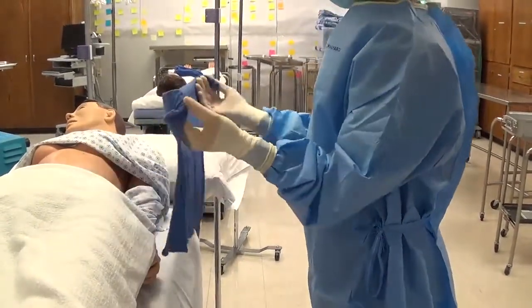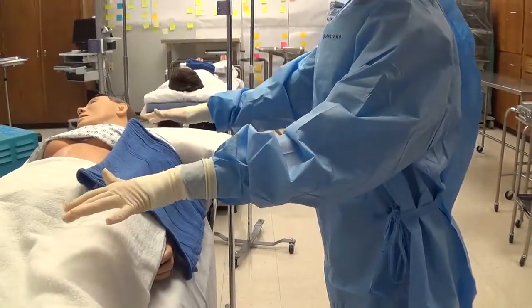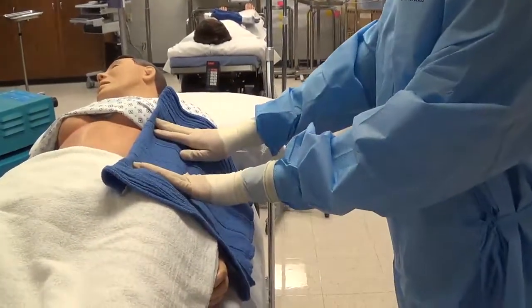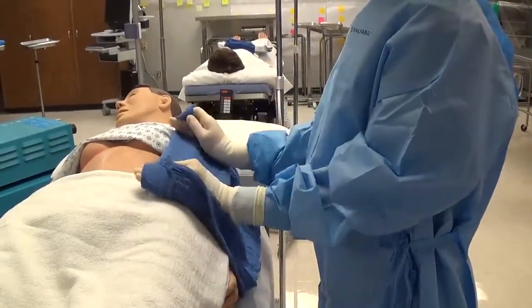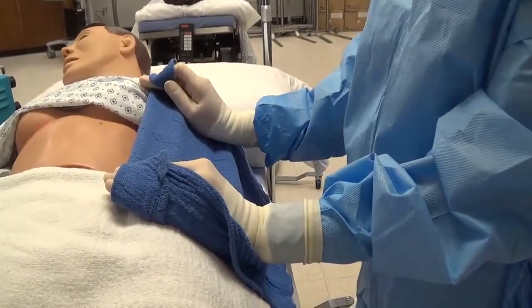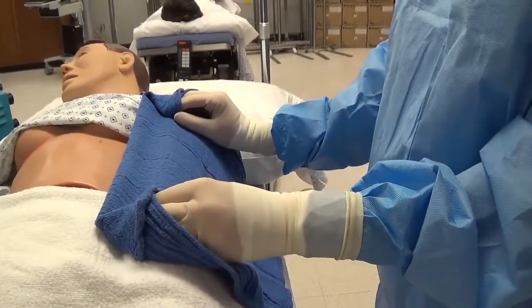When you place the square-off towel, don't open it up like this because your hands get too close to unsterile areas. Simply place the towel and then back your hands off, making sure your fingers aren't sticking out the top of the cuff. Sometimes students do this thing where fingers stick out the top — they're not protected. Make sure you're backed up so they're completely covered and protected from contamination.